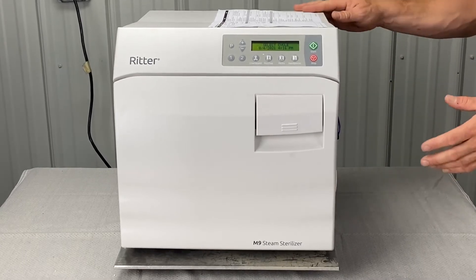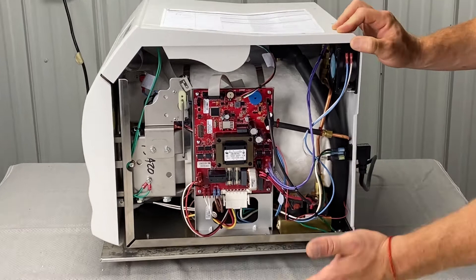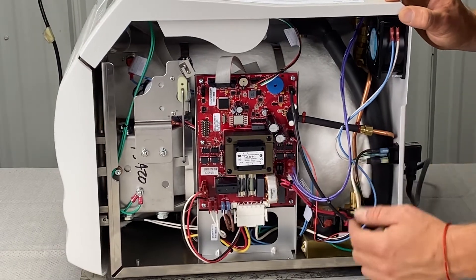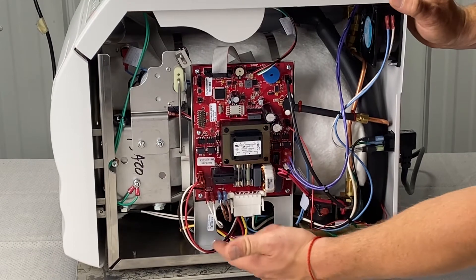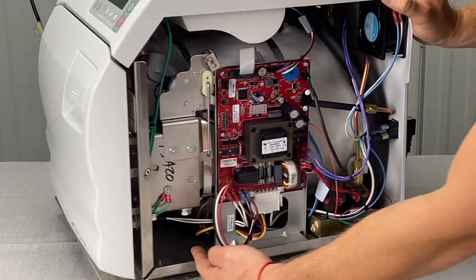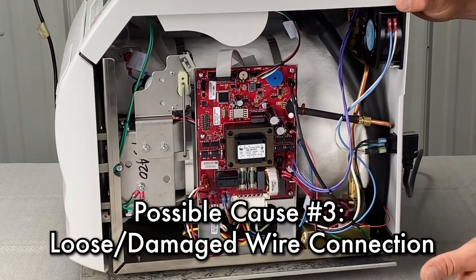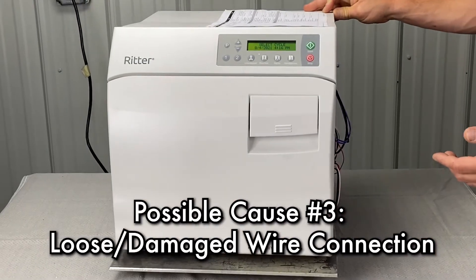We'll have to take the right side panel off. There you'll be able to reveal burnt or bad wiring. Look in the back at these connectors — the white and the black wire — for burnt connectors. Look for burnt fuse holders on the green boards, and look under here with a flashlight where the overheat and over-temp thermostats are. If you see burnt connectors, we'll have to replace those before running the next cycle.